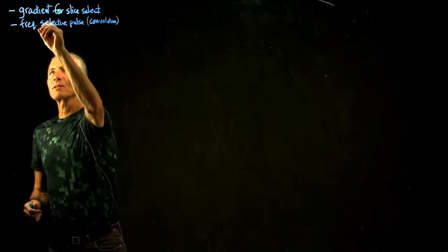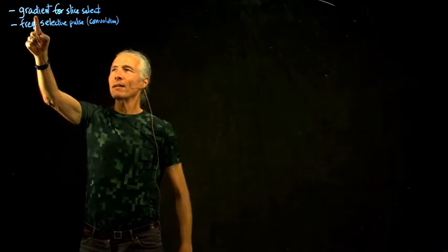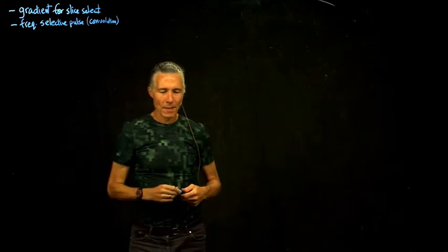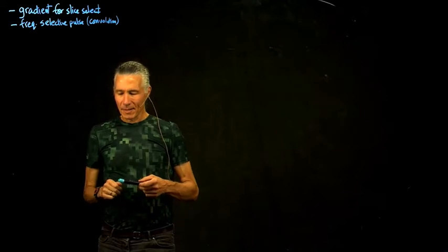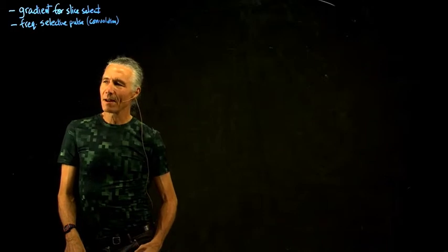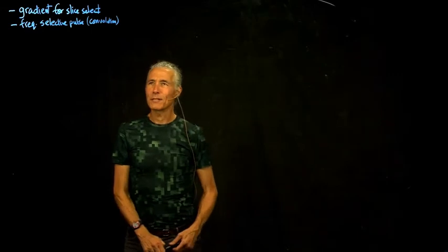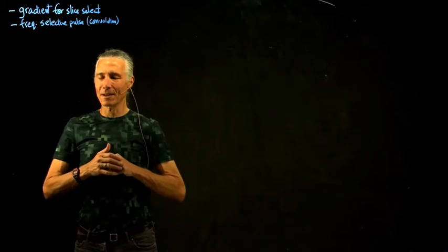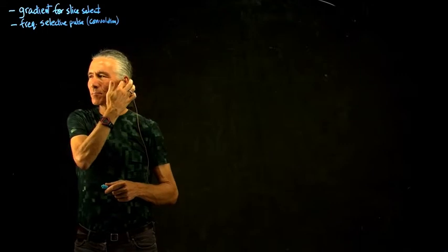Most people have a general idea of how it works, but just as important as the gradient is this idea of a frequency selective RF pulse. And so we'll start off talking about how the gradient works. Then we'll have one equation for how we get a frequency selective pulse, and then we'll do convolution, the convolution theorem. We have to do all the greatest hits of engineering practical math, and so the convolution theorem is an important one.